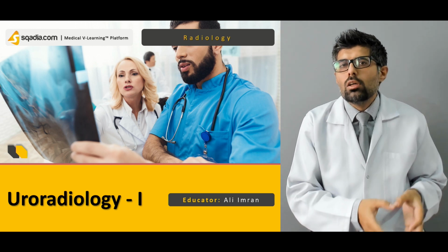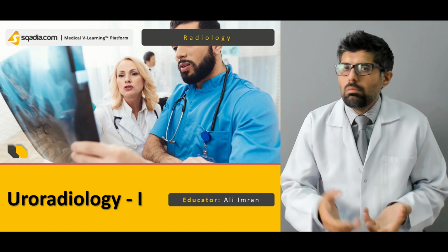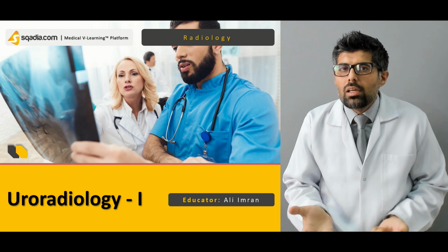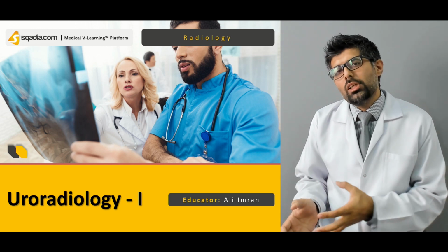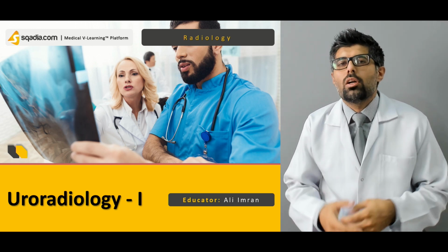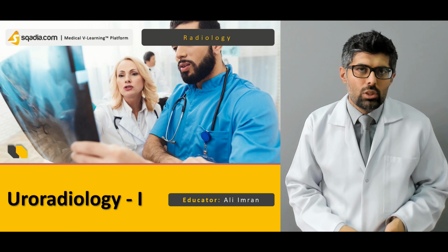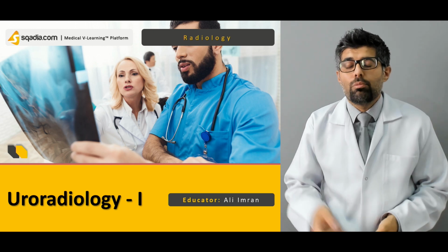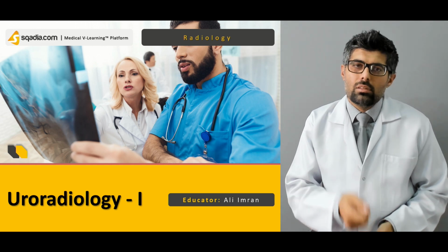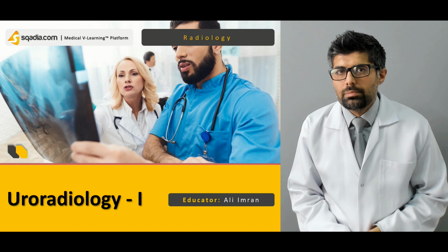Normally, the imaging of the urogenital system relies on ultrasonography. Why? Because it's fast, it's reliable, it's quick, and it doesn't give any ionizing radiation, but it also gives us very reduced resolution. And a lot of diseases and various conditions cannot be picked up on ultrasound. So for a more detailed study of both the cortex and the medulla of the kidney, ureter and the urinary bladder, a contrast enhanced CT scan is required.